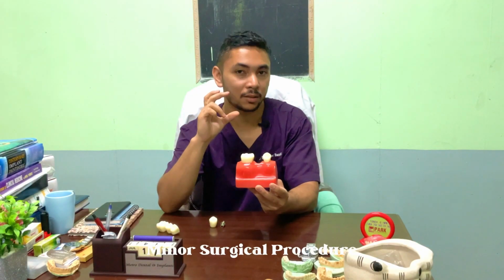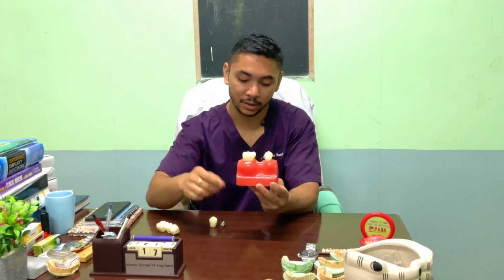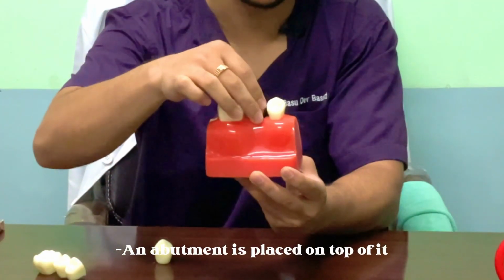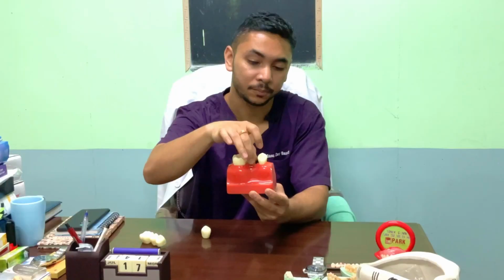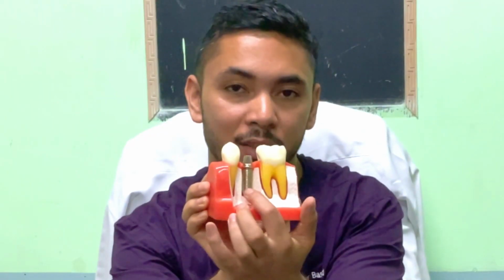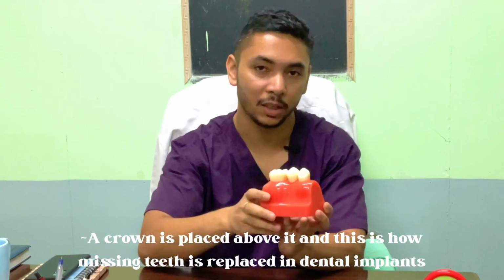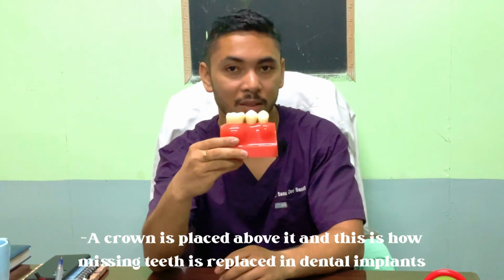It requires a minor surgical procedure to place a dental implant, and once it is placed, an abutment is placed on top of it. So it looks somewhat like this. A dental implant is placed and an abutment is placed on top of it. Once it is done, an impression is taken and then a crown is fabricated which is just placed above like this, and this way we can replace a missing tooth.